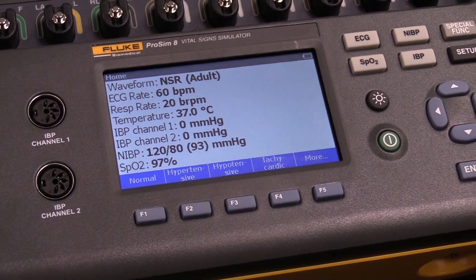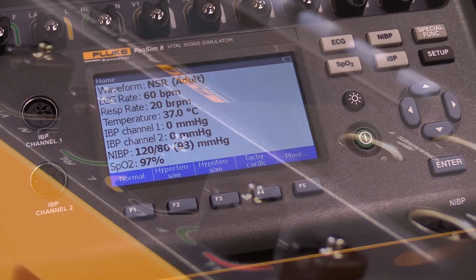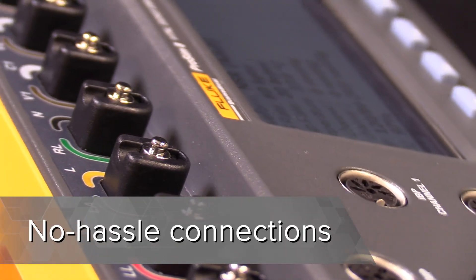Patented secure ECG cable connections are compatible with both snaps and banana jacks. There are no adapters, no modules, and your leads don't pop off.